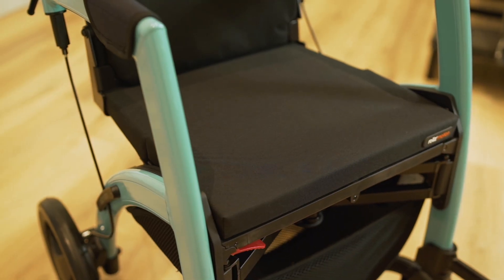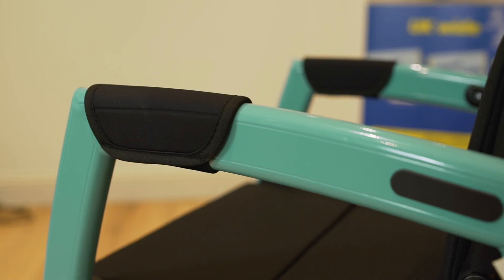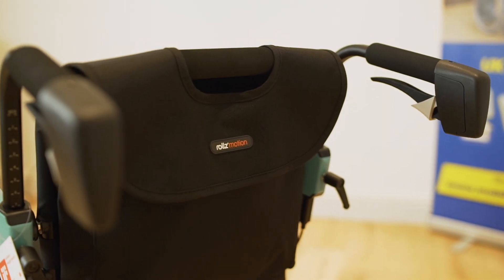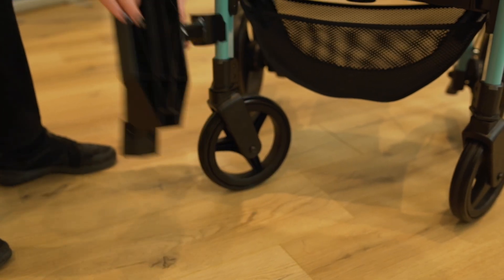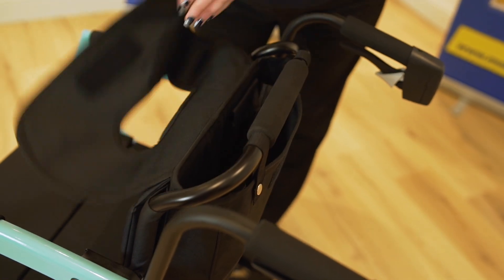The comfortable and removable seat cushion means that the user can easily rest when needed, and removable fabric sleeves protect the elbows when walking. It's easy to transform your Rolls Motion 2 into a wheelchair and back whenever it suits you. The easy-to-fit and remove footplates give the user the option to support their feet when required.